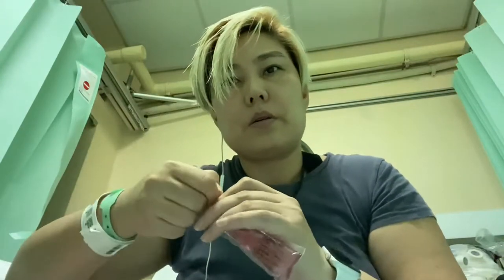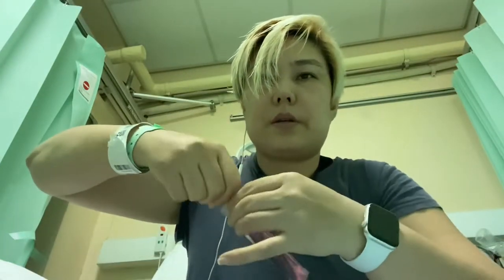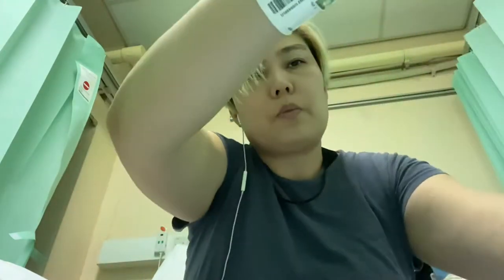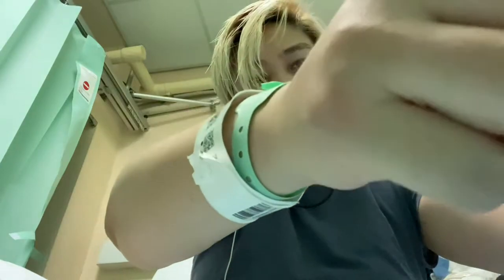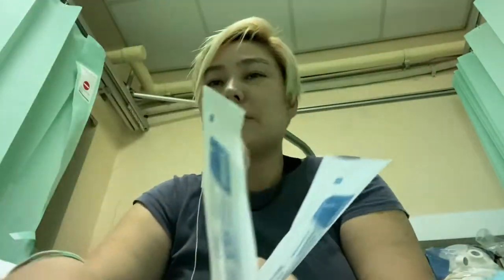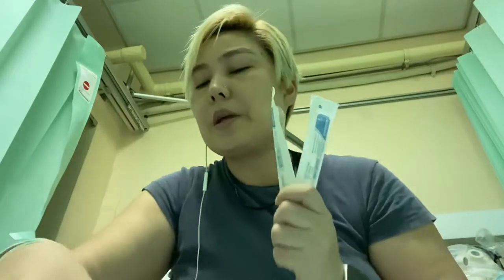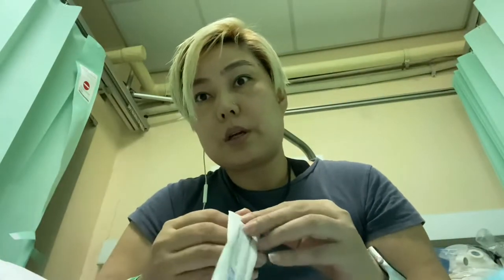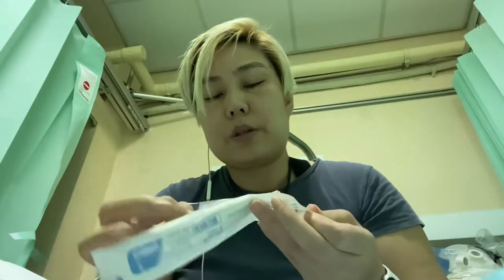I'm opening the solution to put in the container section. I do the dressing like twice a week — in the morning and in the evening. And now it's in the morning. Actually I made this video yesterday, but they suddenly turned off the light — I mean the nurse. I'm still staying in the rehabilitation center. So I'm doing this again. Anyway, morning and evening.